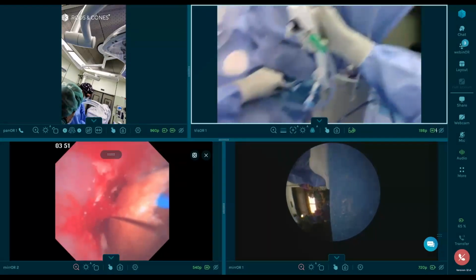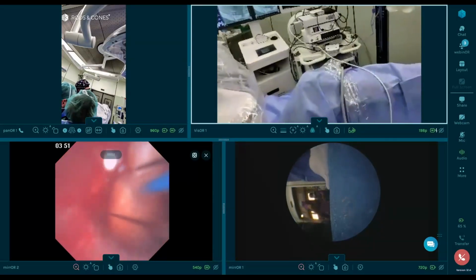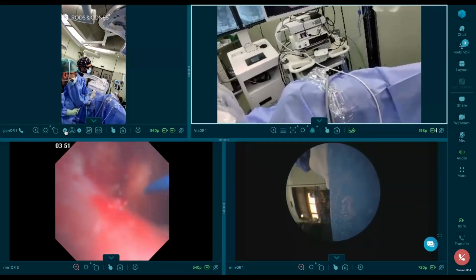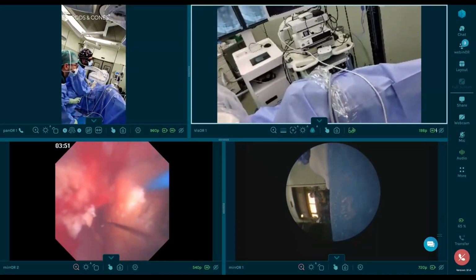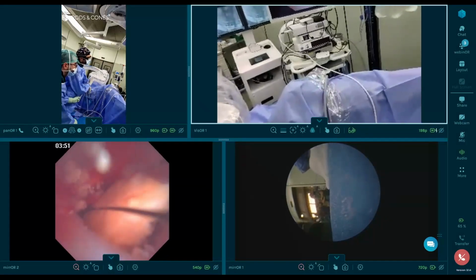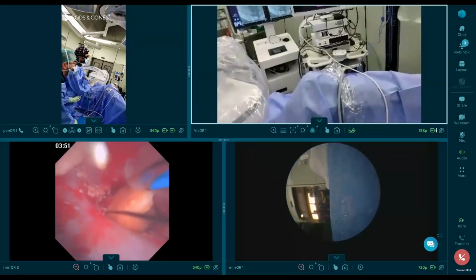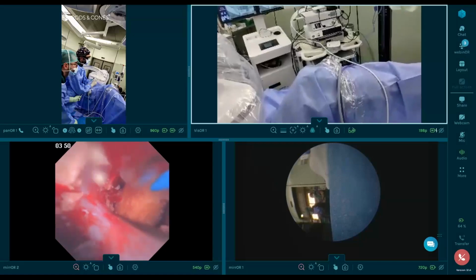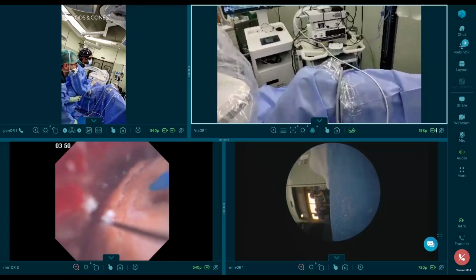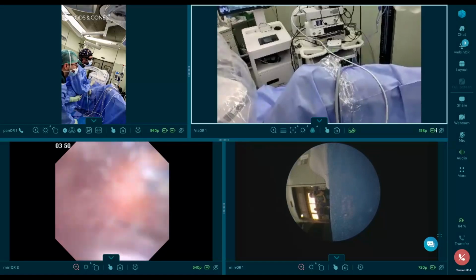I have my pedal here underneath. And then I can just start the lasering. Dale. Con la bomba manual. A little bit too hard. This looks like an effective stone. Exactly. It's already cut in half. That's good. And once it is cut even more, we can release the basket and just forget about it.